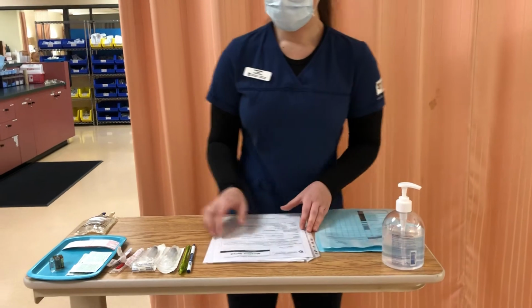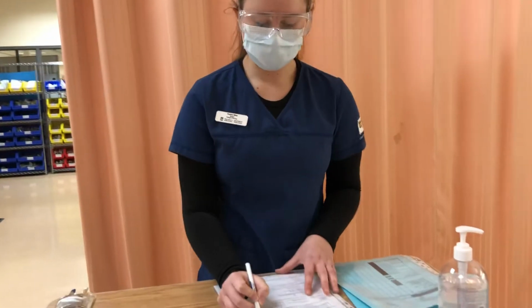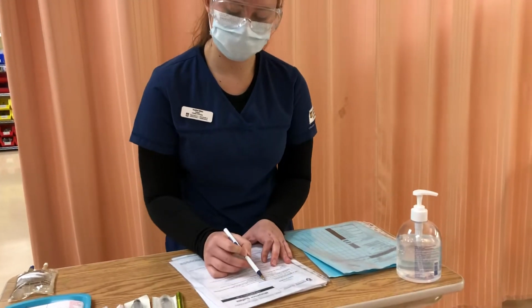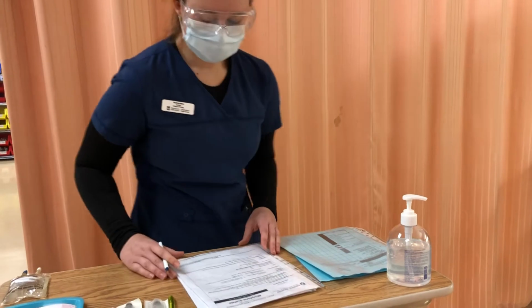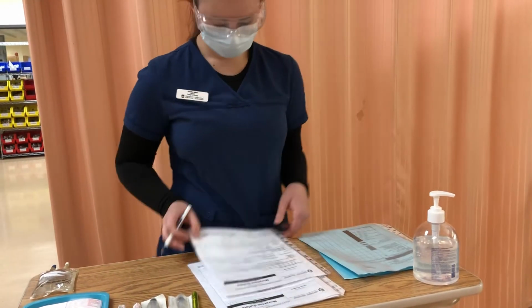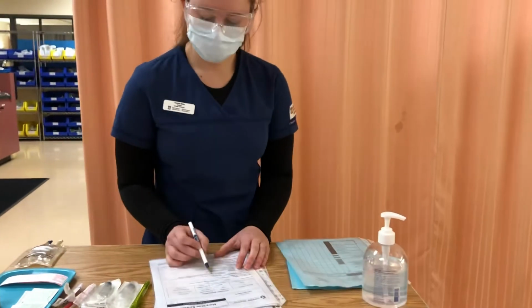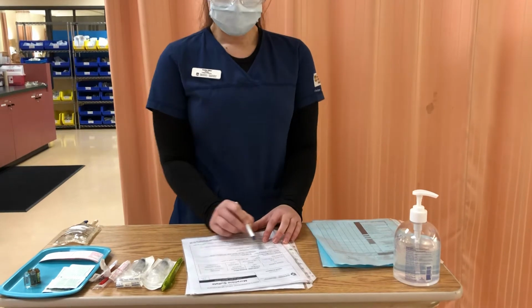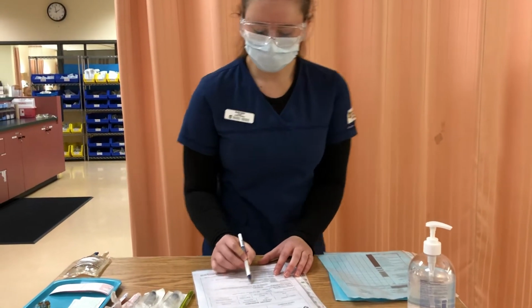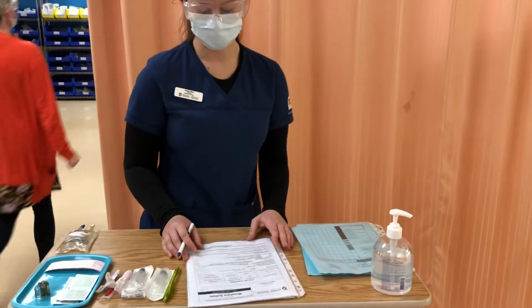So I'm now going to take a look at my parenteral drug monograph. So this is for morphine. This is a high alert medication. It's an opioid analgesic. It can be given by a student nurse, and I've reviewed the WRHA policies surrounding giving this as a PCA. Make sure I don't miss anything. So this is compatible with D5W, normal saline, and various other things, but I'll be using normal saline. Some hazards are respiratory depression, shortness of breath, confusion, hypotension, nausea, vomiting. I will be letting my patient know about those before starting the infusion.